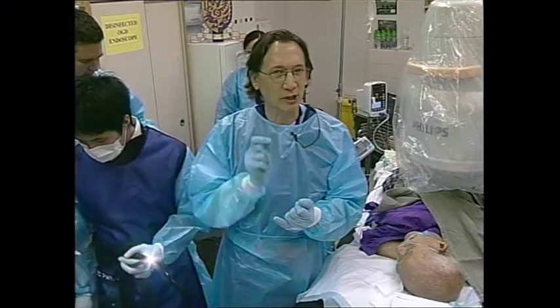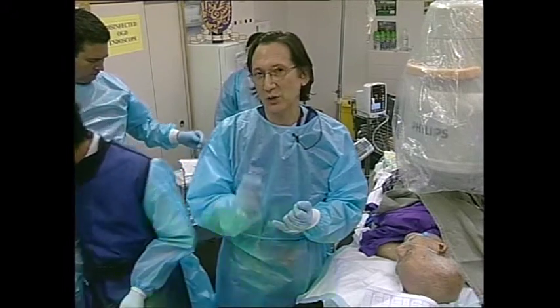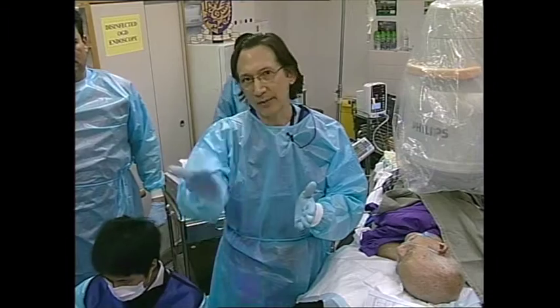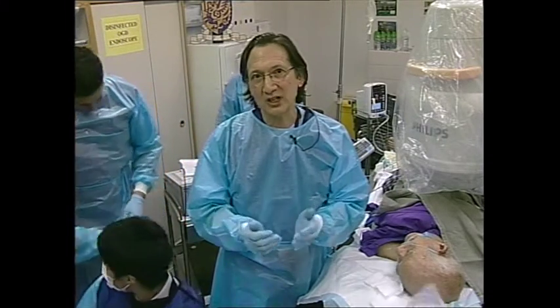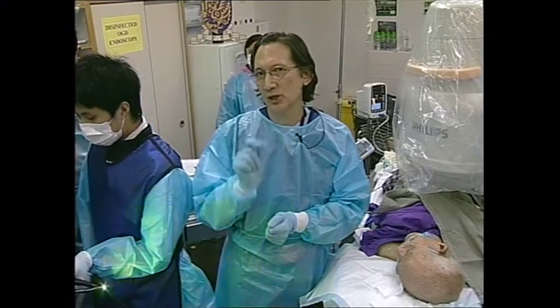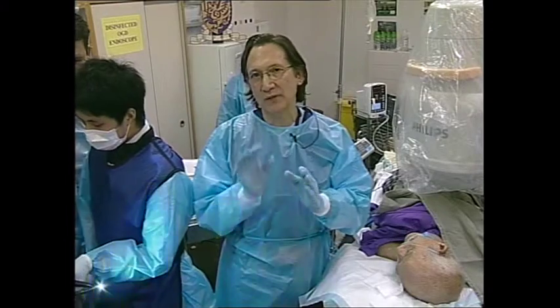Otherwise, it's called an acute fluid collection. So if it's a pseudocyst, it's been there 6 weeks, and 6 weeks is enough to create fusion with the stomach wall, for example, or the duodenal wall. Walled-off necroses are also defined as being present for at least 6 weeks. So there, again, you usually have good fusion.